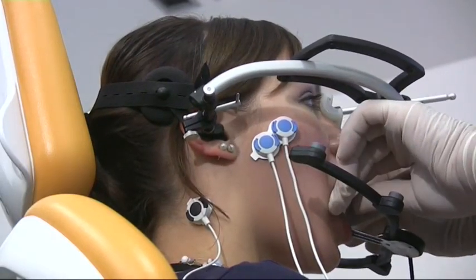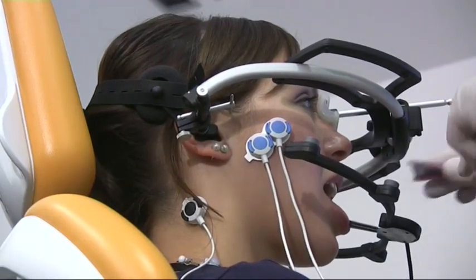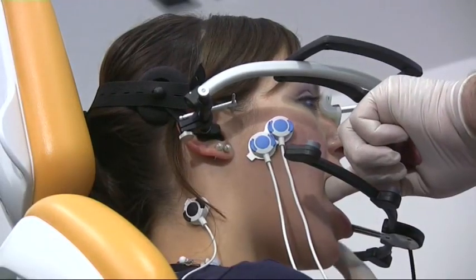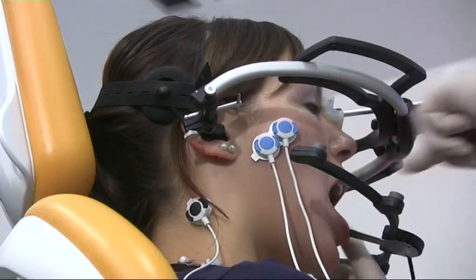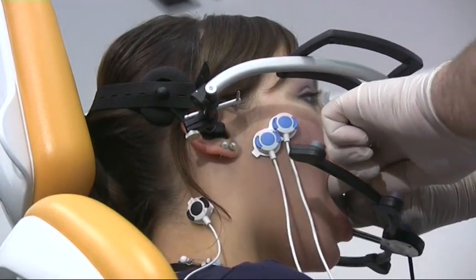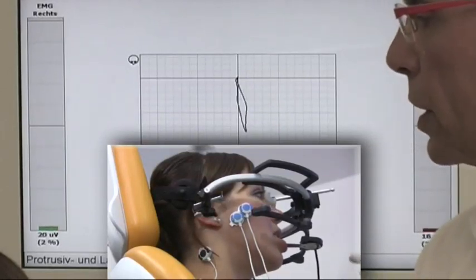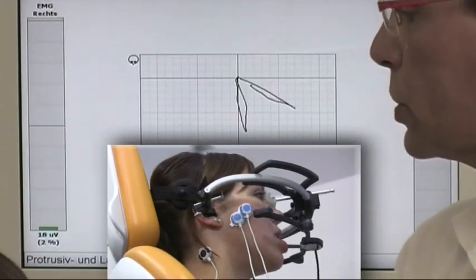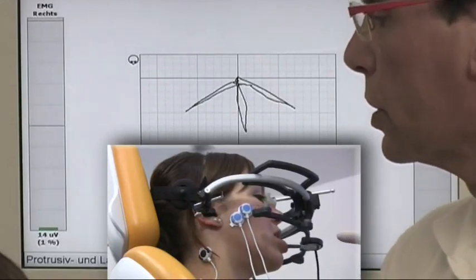The cotton wool rolls are removed. Leave your mouth open, the registration aids are inserted. First the lower jaw, then the upper. Now push forward and back. Now to the left and back. Right, back. Now to the right and back. Once more forward and back.